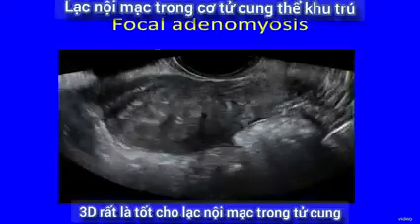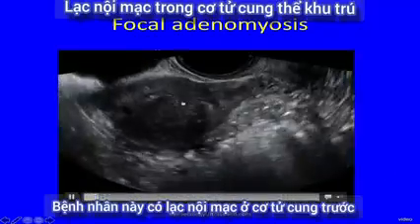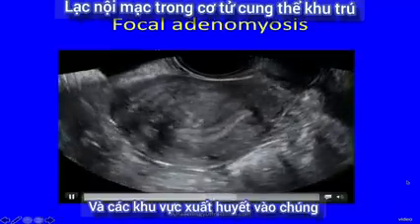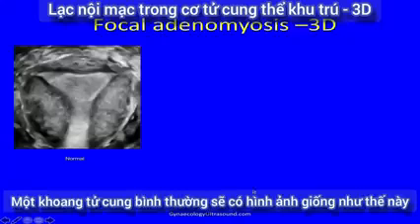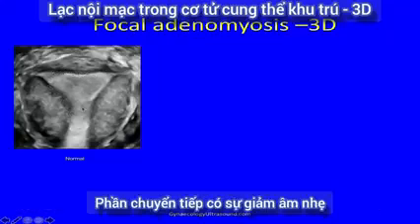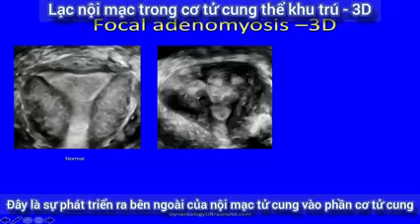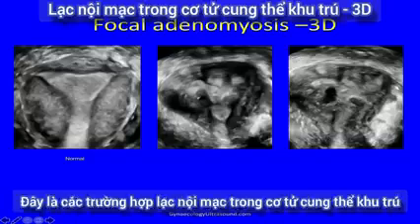3D is very nice for adenomyosis. Here this patient has adenomyosis in the anterior myometrium. You can see the endometrial cavity, islands of ectopic endometrium, and areas of hemorrhage into them. If it's less clear, this is what a normal cavity would look like, with the endomyometrial junction showing as a slightly hypoechoic, almost transitional junction. And in this case you can see the out-budding of endometrium into the myometrium, with areas of hemorrhage visible in a slightly different plane — this is focal adenomyosis.